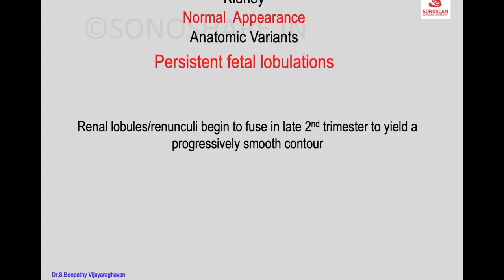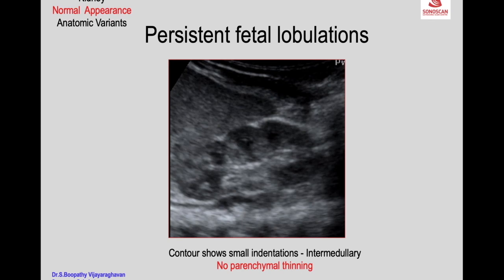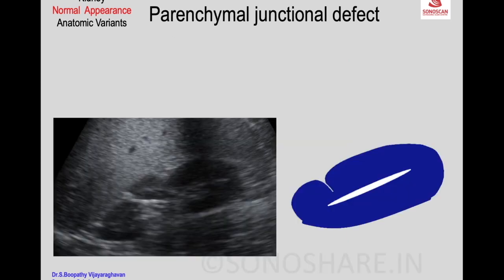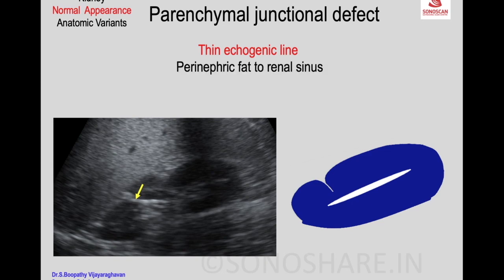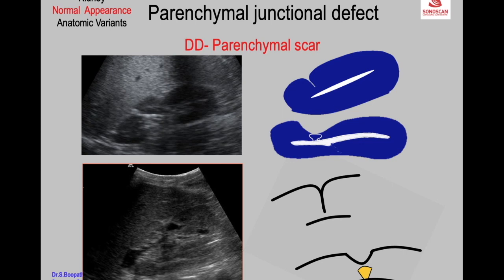Persistent fetal lobulation seen in neonates can persist: renal lobules begin fusing in the late second trimester to yield a progressively smooth contour, but sometimes this fusion is incomplete and the contour shows small indentations between the medullary pyramids with no parenchymal thinning. The parenchymal junctional defect is seen as a thin echogenic line extending from perinephric fat to the renal sinus between the upper and mid-third junction, more common on the right side. The differential diagnosis is a parenchymal scar; in a junctional defect the contour defect angle is acute, whereas in a scar it is obtuse, and the underlying calyx is normal in a junctional defect but blunted in a scar.